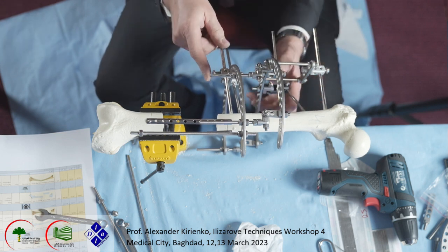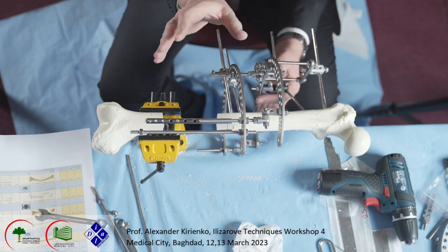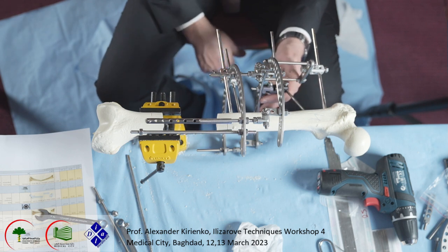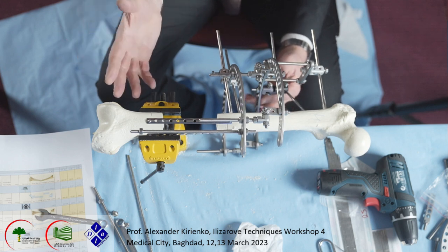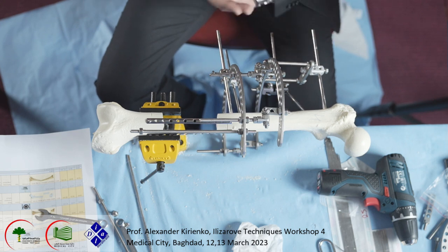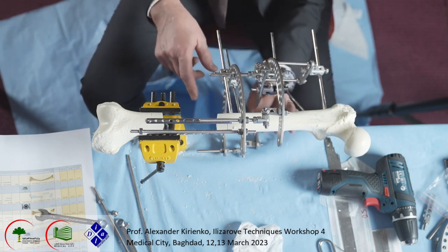And in this situation, we may do shortening, acute shortening. The femur, you may do it more. But you should pay attention to the sciatic nerve, because if you do too much shortening, the arteries kink like this, and there is a risk of thrombosis, vein thrombosis, or some kind of lesion of the artery.